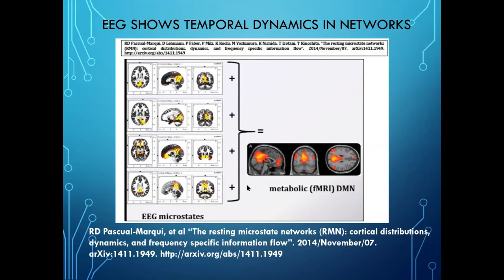Well, what you really have in EEG land, where you can actually look at it millisecond by millisecond, not smeared across 2 to 10 seconds to create an image, but actually real time, is that for about 82 milliseconds, the brain holds a semi-stable state and it switches to the next one, which it holds for about 82 milliseconds, plus or minus 4. Again, a little bit of time to switch, but it holds this pattern, which is the posterior cingulate off to the left side. And this is a bidirectional pathway. And it's not just alpha, it's also beta.